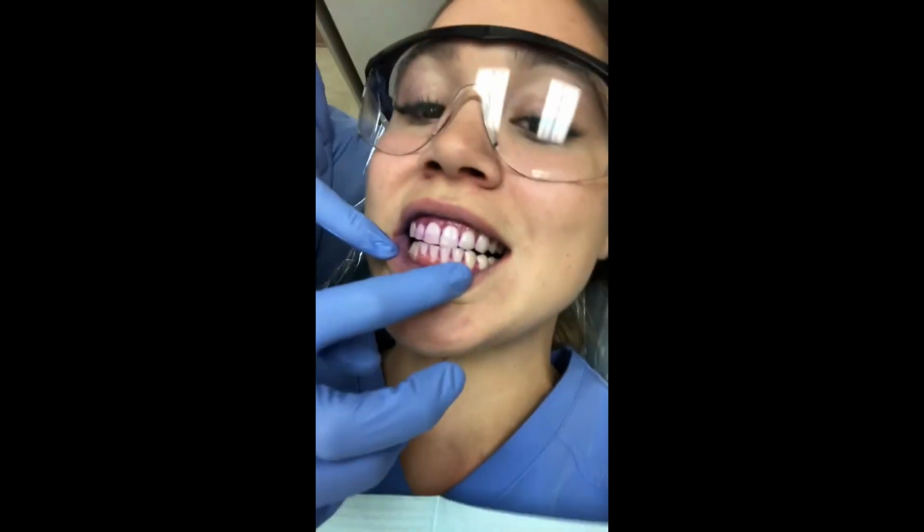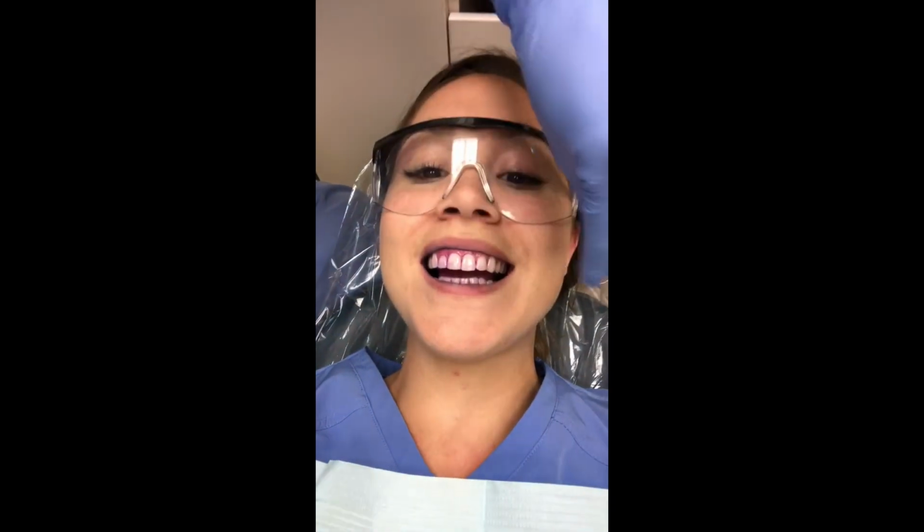So what I like to do is I'm right-handed, so I'll have an over glove on my right hand, and then I will use my mirror and retract and then record all surfaces that have the disclosing solution on them. Ta-da!